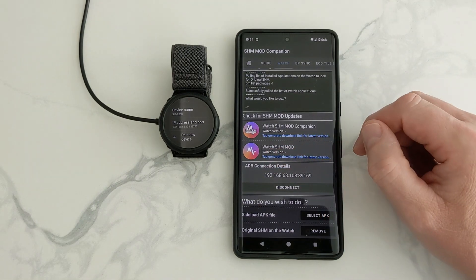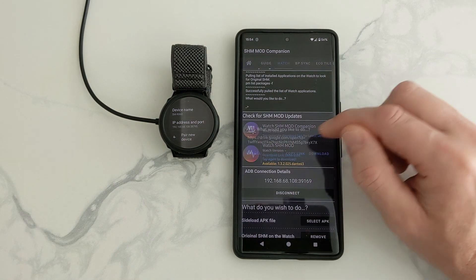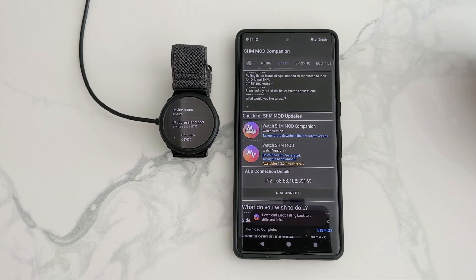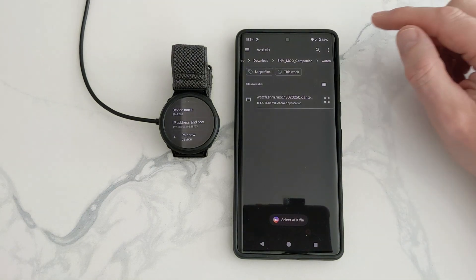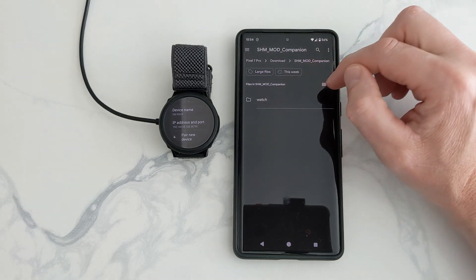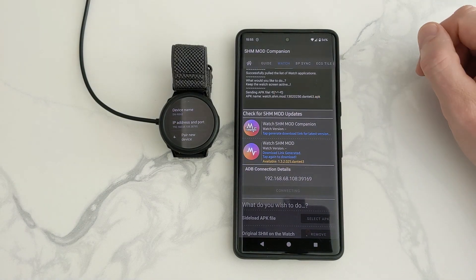Now we need to download the watch app, which is this one here. We click it — it generates a link, then you click it again. You go to Download, and we'll just let that download. Once it's done, we will dismiss this at the bottom, and then we're going to sideload the APK file we've just downloaded. Select APK — it'll take you to your files and your Downloads folder on your phone. A folder's already been made: Left Watch. And that's it there, we just click it. Now it should start installing the app on your actual watch.